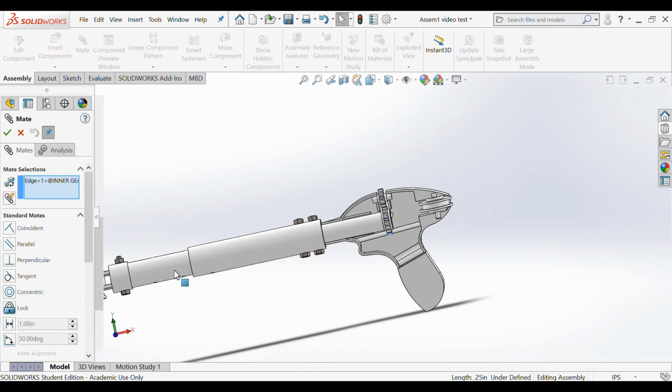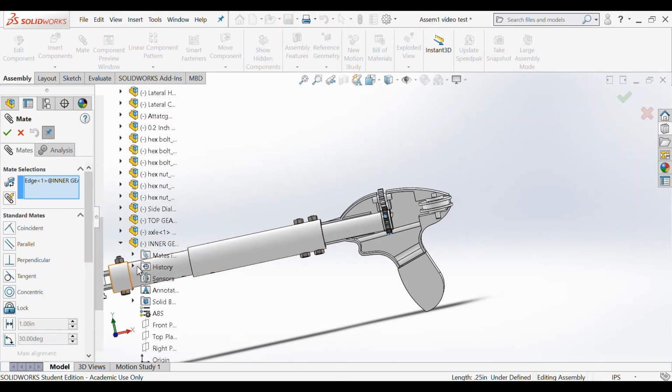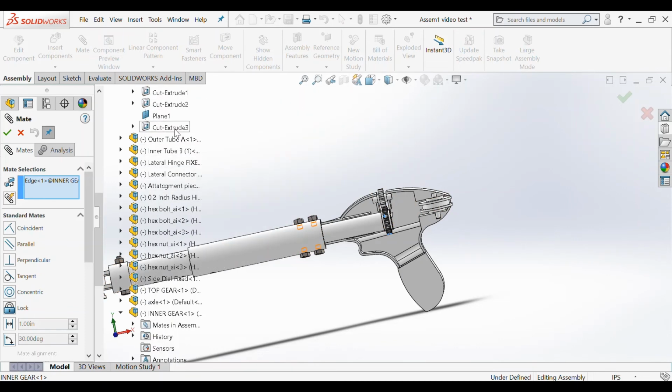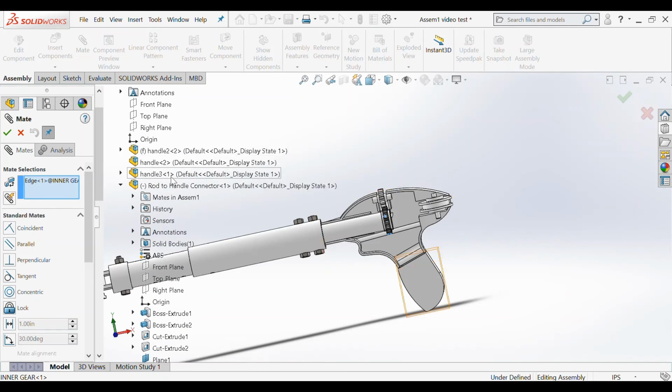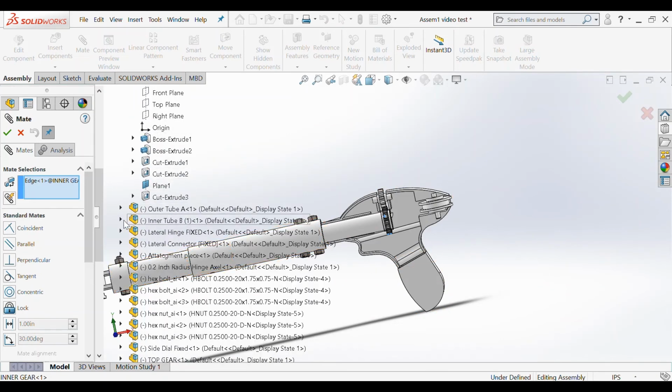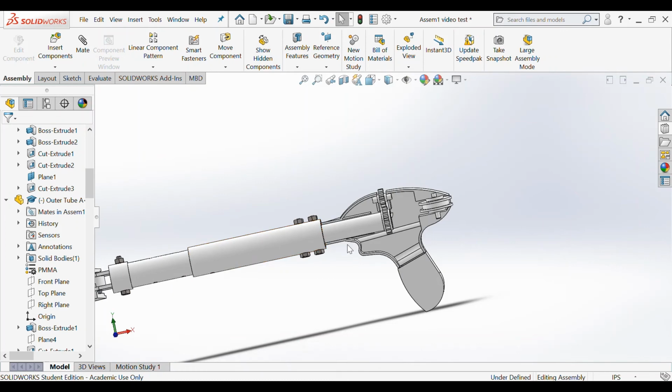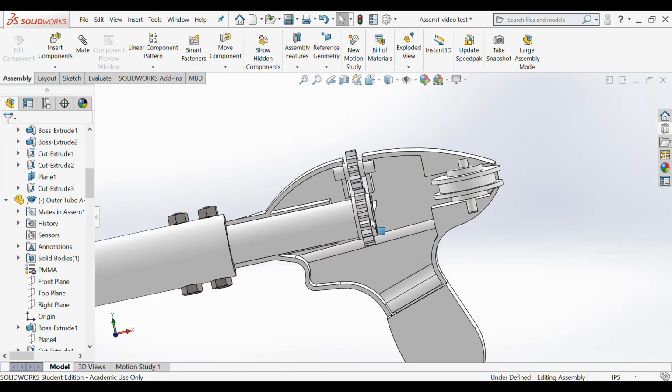Next, I'm going to go on ahead and do the same for the inner gear. So we're going to choose the top plane of the gear, and then we're going to go on ahead and find the inner tube and choose its top plane, and we're going to make those two planes coincident as well. So that will allow the whole fixture to move simultaneously.